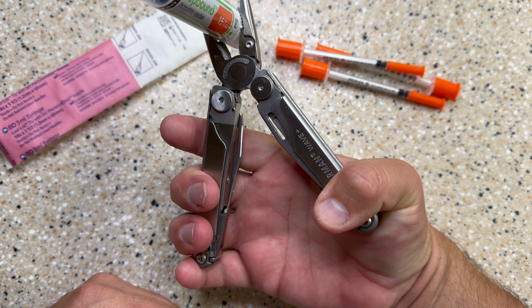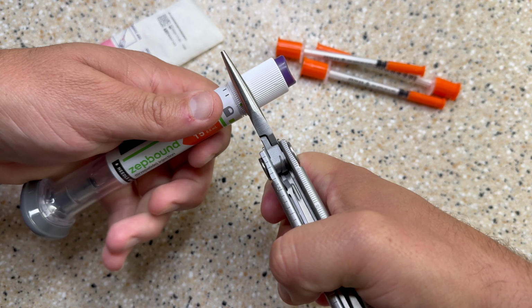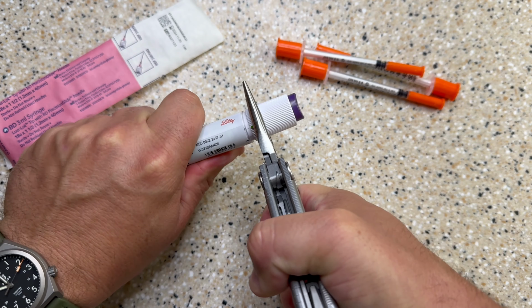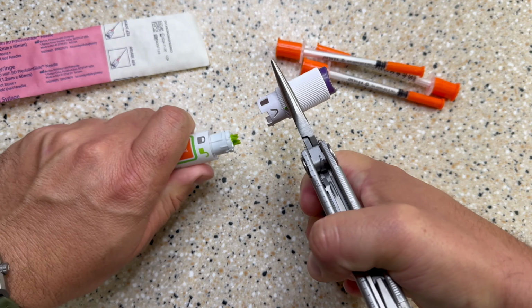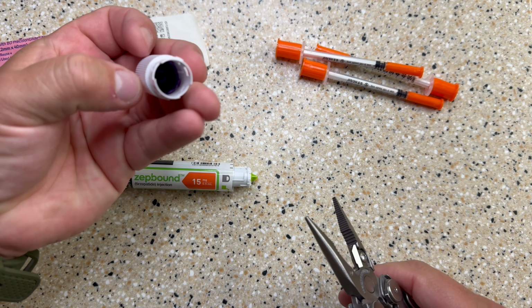As you can see, my hand is pretty extended. Here we go. Rotate clockwise, rotate toward the lock. And you also want to pull out while you're doing it. Okay, so this is out. That's what's in here.